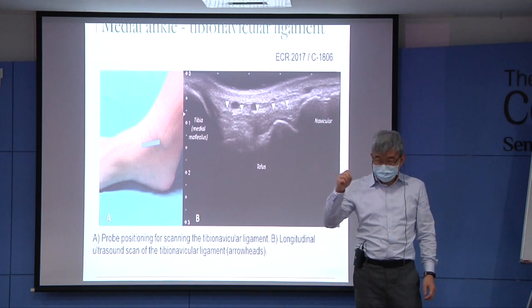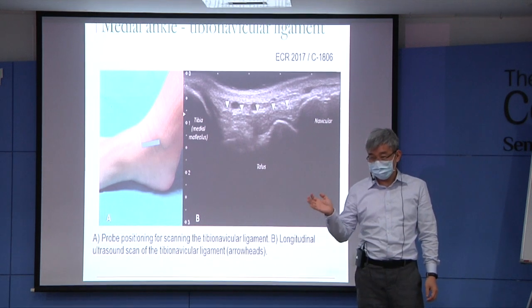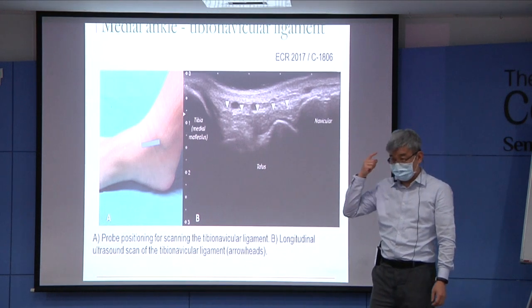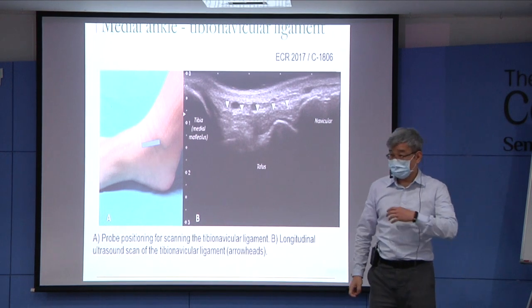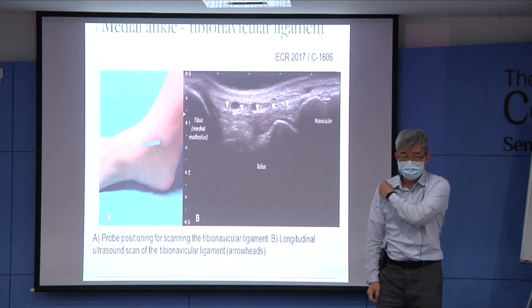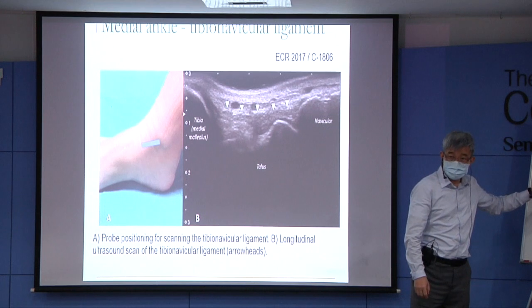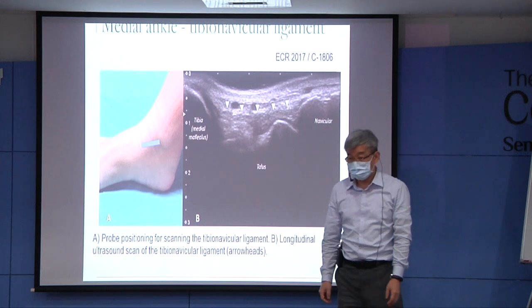If it is, we carry on our treatment. If not, the patient does not have to wait for a long time for a poor outcome. He knows the result a little bit early, so he can decide what his next step is. Okay, and there were a lot of holes over the plate and the screw from the previous operations, but we don't mind at all. We just find the callus and check the blood flow in the callus. That is a very successful case in our clinic.